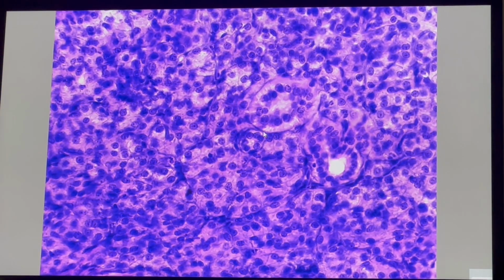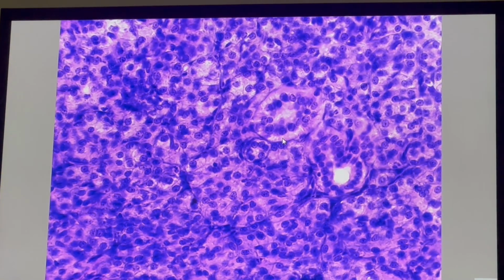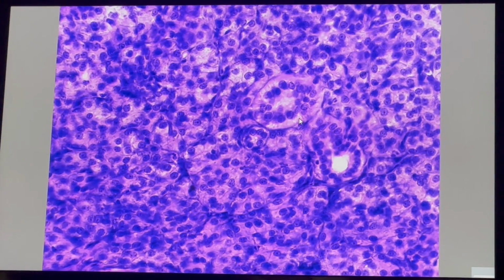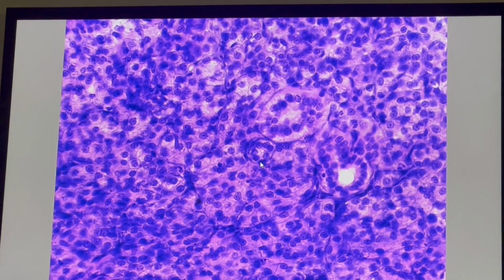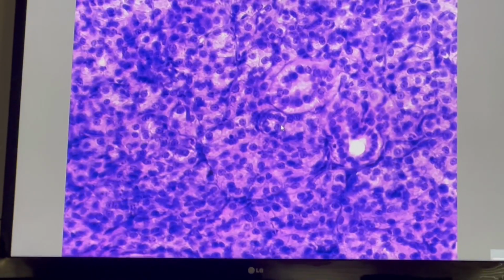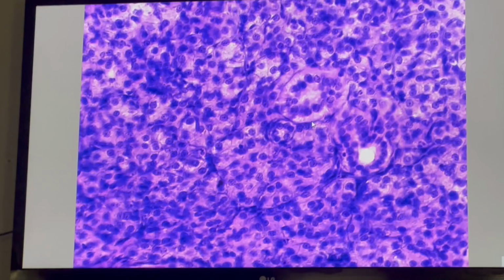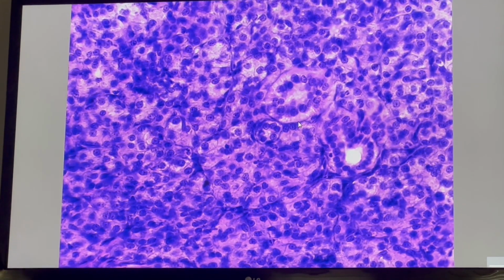The whole structure is called striated duct, characterized by the presence of basal striation. This is intercalated ducts, and this structure is striated ducts. Both intercalated and striated ducts are called intralobular ducts because of their location within the lobule.